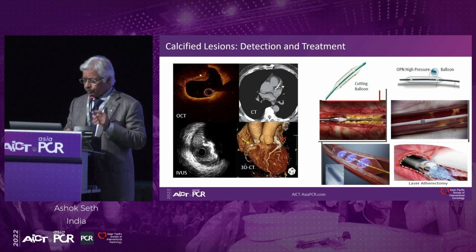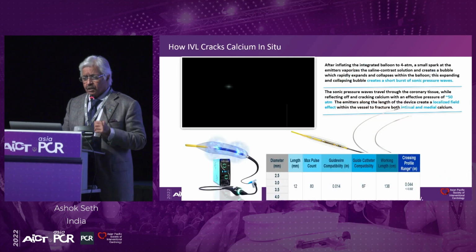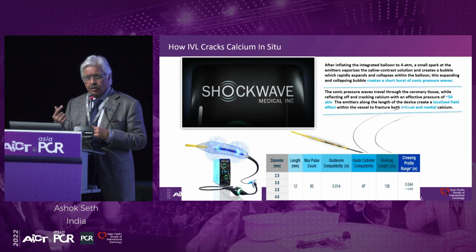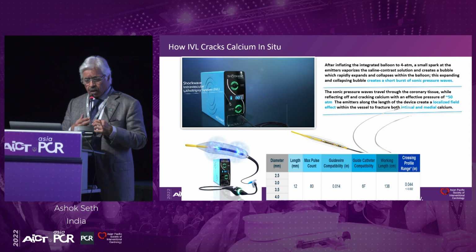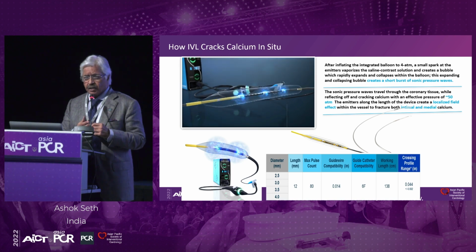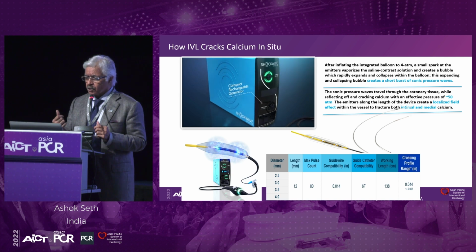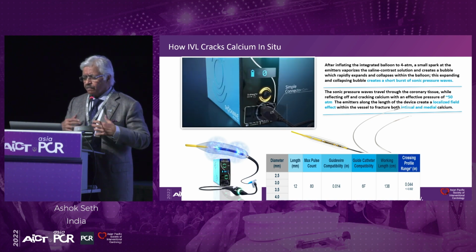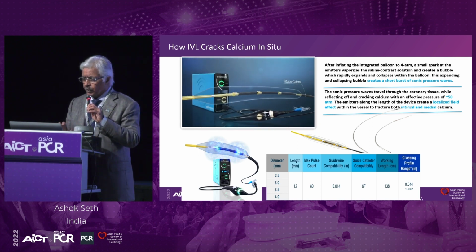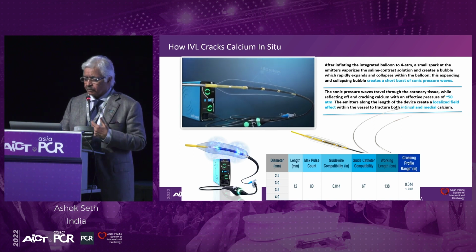But more recently, we also have intravascular lithotripsy. Today, this is what we're going to talk about, intravascular lithotripsy, the device which is easier to use, is effective, but we still need to understand where, how, when, and understand the best practices of using the device to give our patients the best possible results. So we're going to discuss the mechanism of action. You all know that. It is acoustic waves which actually crack the calcium.